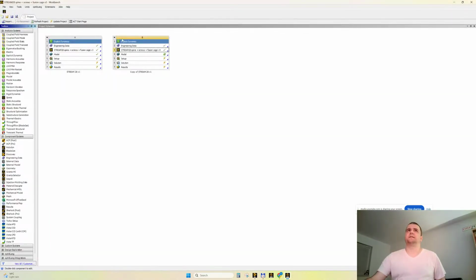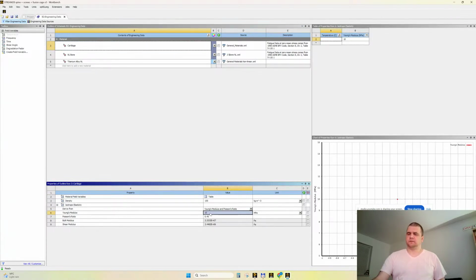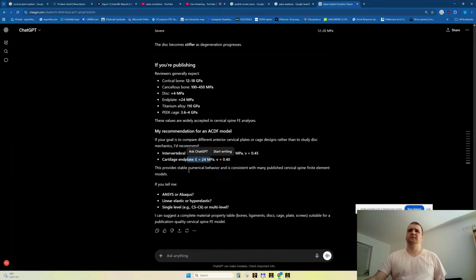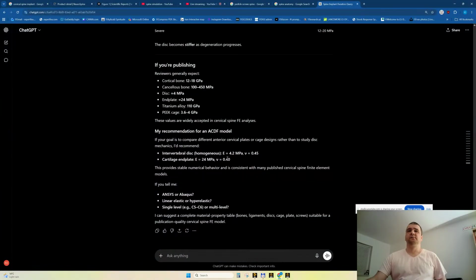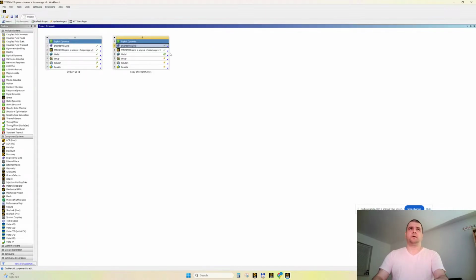In the meantime, I said that for the cartilage, I will make it 24. Should we be so desperate? And plate intervertebral disc, let's make it 24. What Poisson ratio do we have? 0.4. Let's make it 0.4. It will be pretty stiff, let's say. Stiffer discs, slightly, in order not to panic some people.